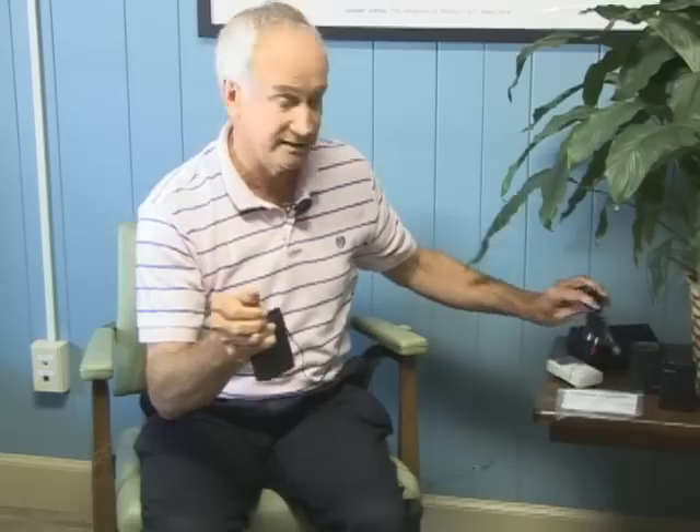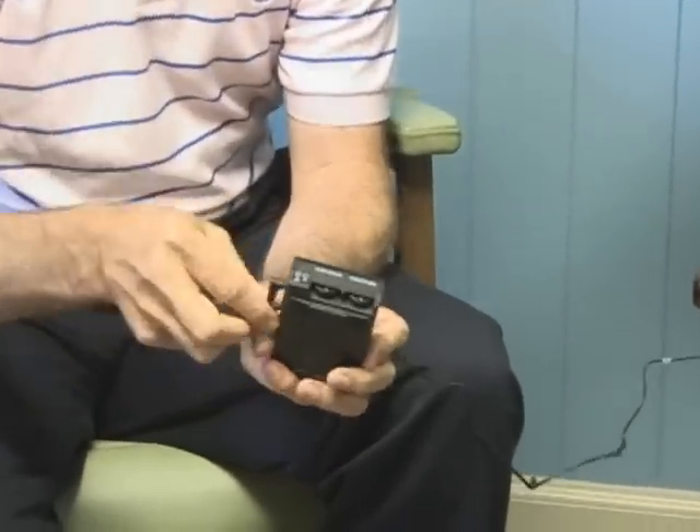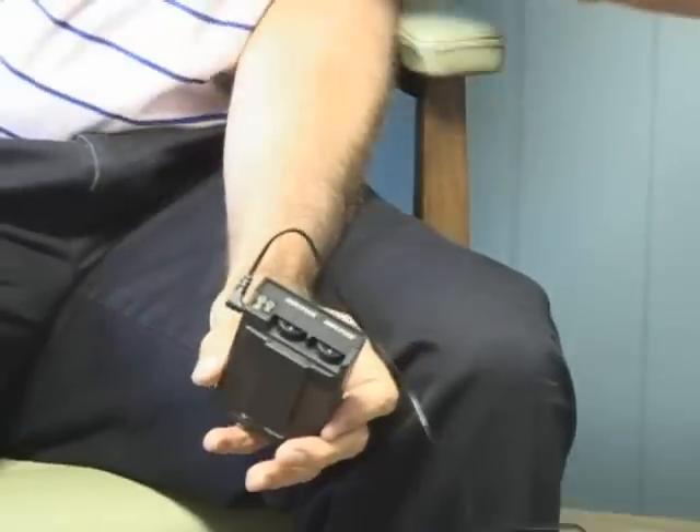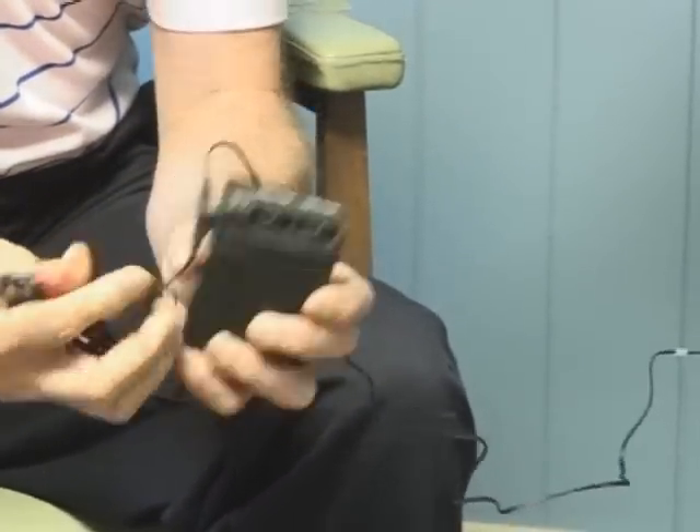You would take your electrodes and put them where you have the pain. Again, look at our other video on electrode placement. With an analog unit, you have buttons at the top for one channel, which is where one set of electrodes are, or for the other channel, which is where the other set of electrodes are.